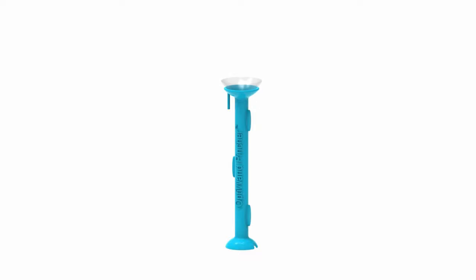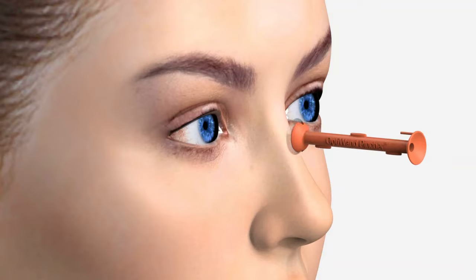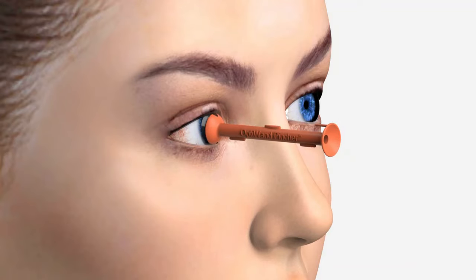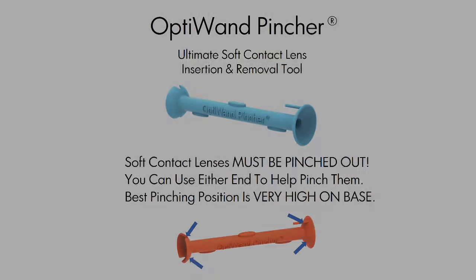Aim the wand at a light source to serve as a guide. Spread your eyes as wide as possible, keeping eyelashes out of the way. Focus on the center hole or contact lens. Draw to eye and twist the wand to release the lens. Blink until comfortable.